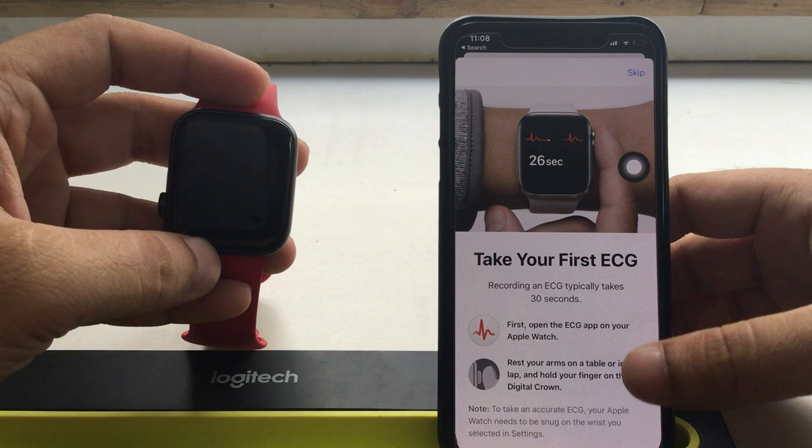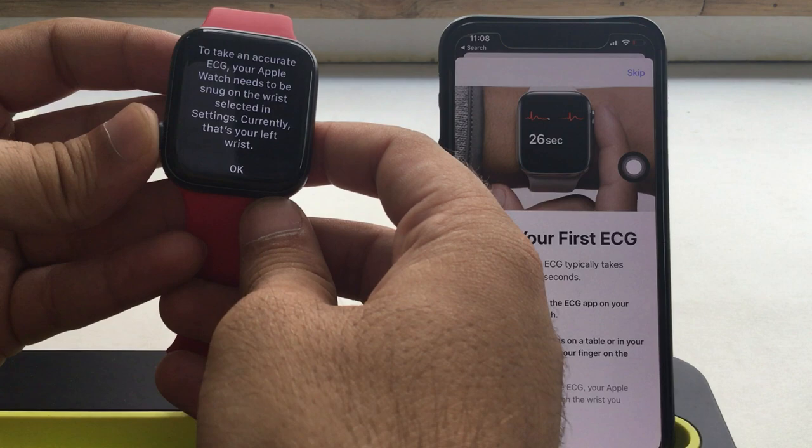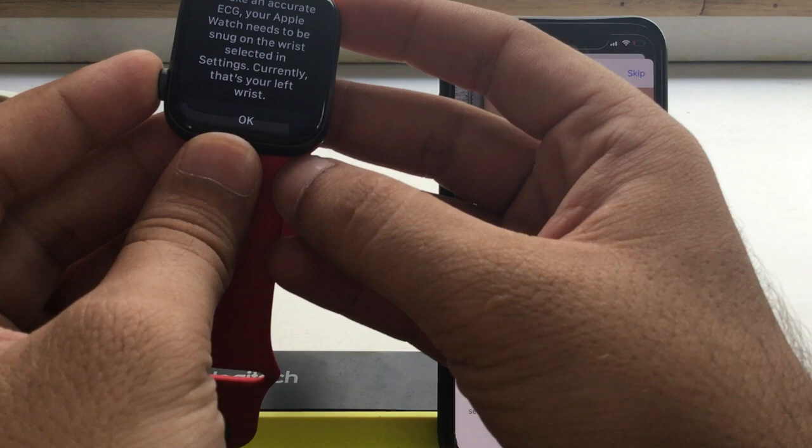Now it's time to take the first ECG test. Open the ECG app on Apple Watch and keep your finger on the digital crown. Your Apple Watch must be worn on your left or right wrist correctly to measure accurate tests. Wait for 30 seconds until the recording is complete.